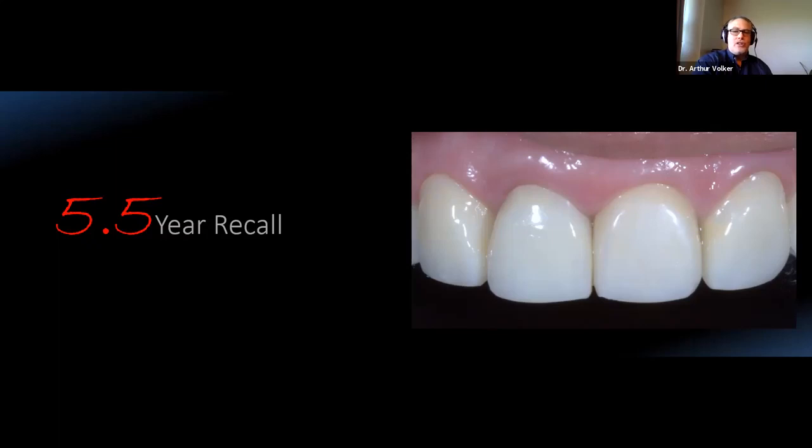Now, I told the patient; she didn't mind whatsoever. She didn't even notice. But again, she sees it from social distance, and I'm blowing it up quite large. But just please be aware: if you see something like that, tell your laboratory to use an internal stain and then a glaze. And also for those of you who are doing it in the office, it might be best sometimes, especially in the anterior, to do a separate stain, then glaze.